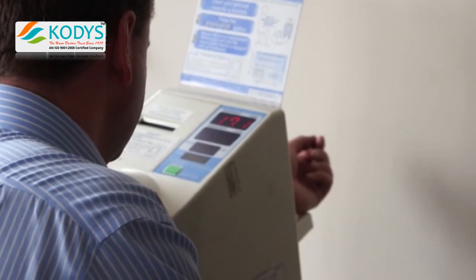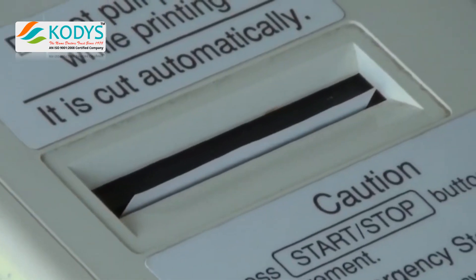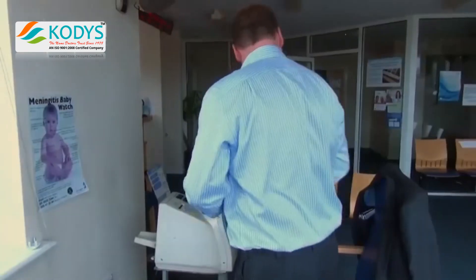A printout is then produced displaying systolic and diastolic blood pressure along with pulse and A&D's irregular heartbeat indicator. Once the printer has completed the readout, the patient can take this either to reception or enter their appointment with the doctor or nurse.